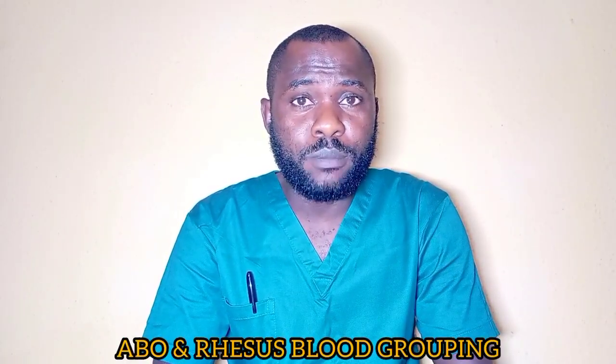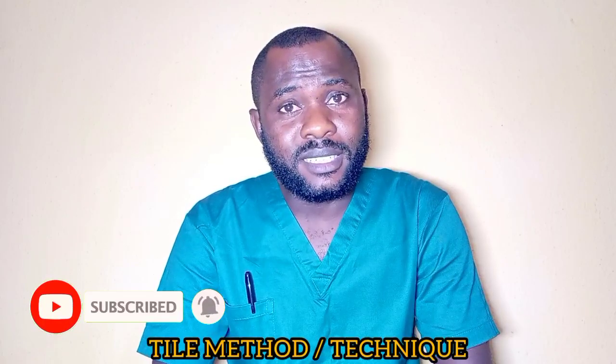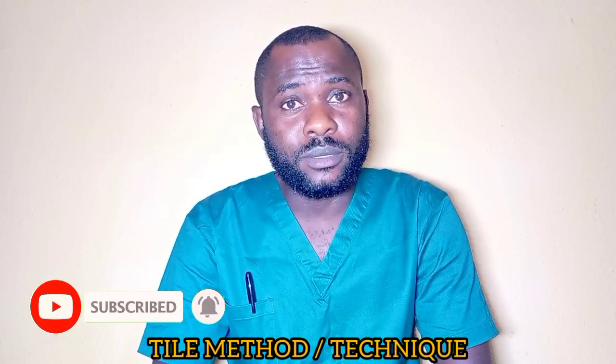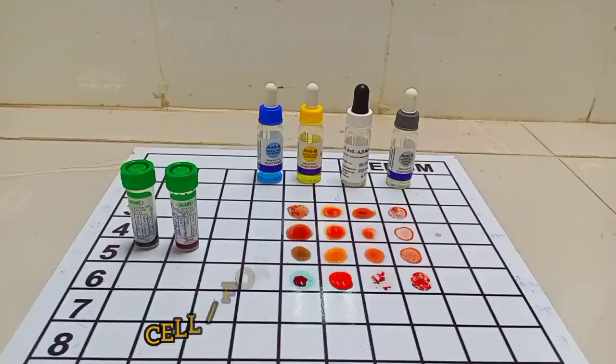On today's tutorial, we are going to be looking at ABO and Rhesus blood grouping. The technique or method we are going to be using is called the tile technique or the tile method. And the type of grouping we are going to be doing is called the cell grouping or forward grouping. So on our tutorial today, we are going to be looking at how to determine the blood group of an individual or the blood group of a given sample.